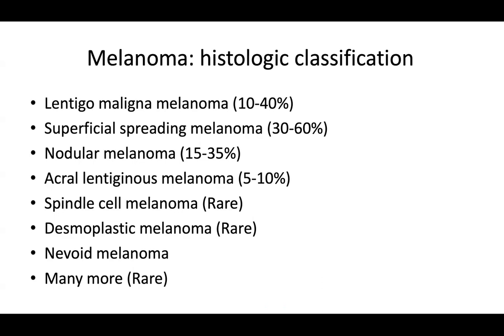And so you'll find this expansion of the papillary dermis where it started. You may find even a collarette. You may find ulceration, which makes it difficult to truly say if there was either, yes, a prominent radial component or not. But nodular melanoma, by definition, cleanly is that it has a very small focus of junctional involvement.